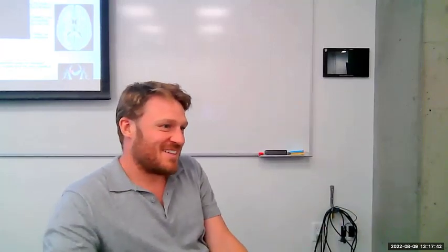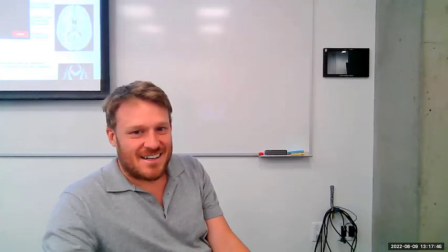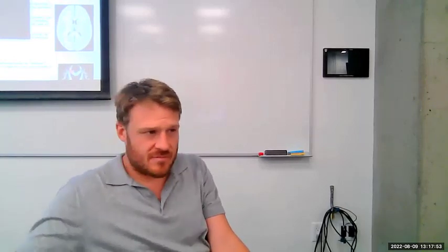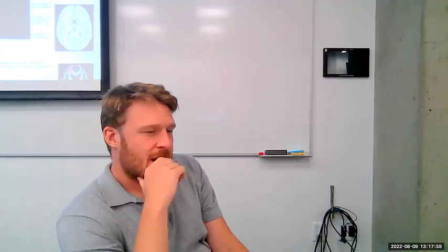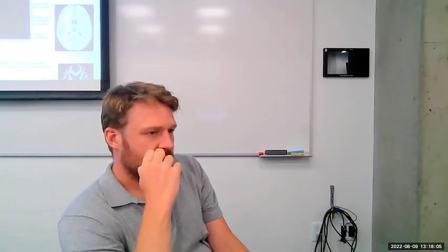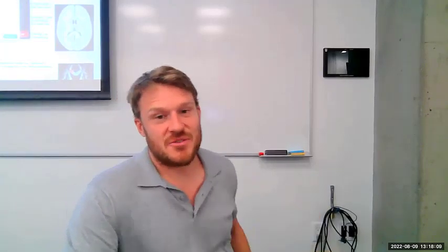Thank you. Anyway, so now we know that T1 and T2 generally show opposite signals, because T1 has brighter fat and darker water, and T2 shows the opposite. But my question is, why do they derive this kind of opposite signals? Because if they are totally opposite, then once we know T1 we already know T2.